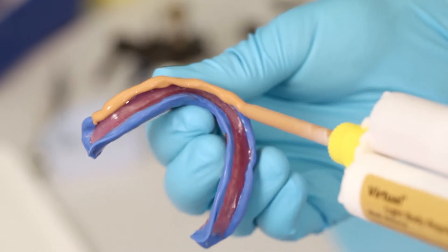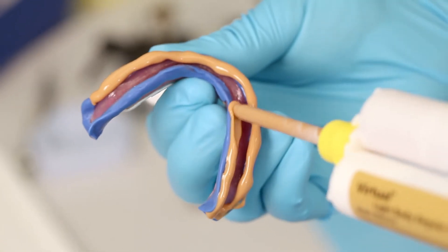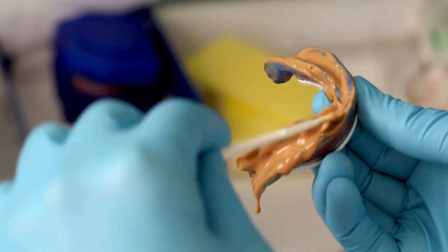Insert the upper impression and ask the patient to carry out the functional movements with her mouth closed. Between the individual functional movements, ask the patient to swallow. This process is always the same: shaping the functional margin with virtual heavy body, taking a wash impression with virtual light body, and any necessary adjustments with virtual extra light body.